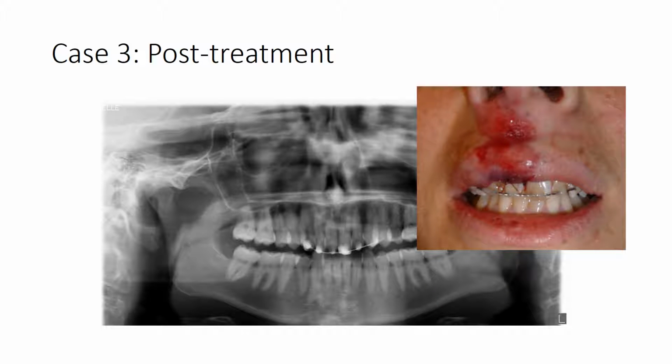Same patient post-treatment, showing improved alignment. You can see there's no longer a space between the maxillary teeth.